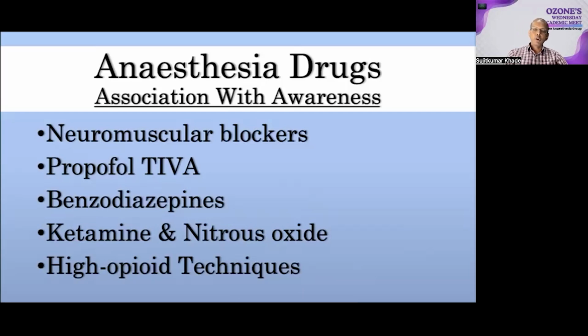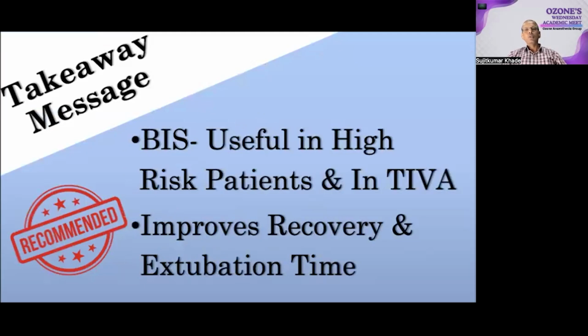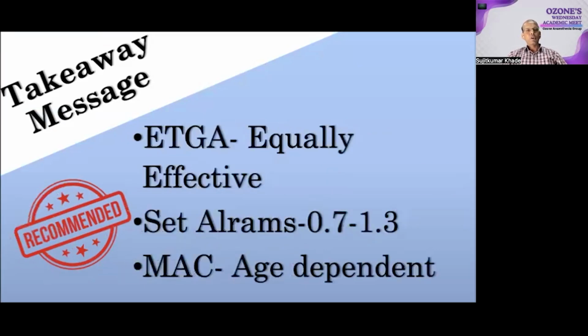So, to conclude, the routine use of BIS is not advocated, but BIS is definitely useful in high risk patients in TIVA and significantly improves the recovery time and the extubation time. So, this is particularly useful in airway surgeries, in OSA surgeries. The end-tidal anesthesia gas monitoring is equally effective to monitor the depth of anesthesia.